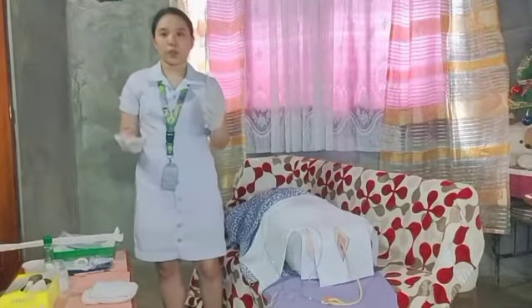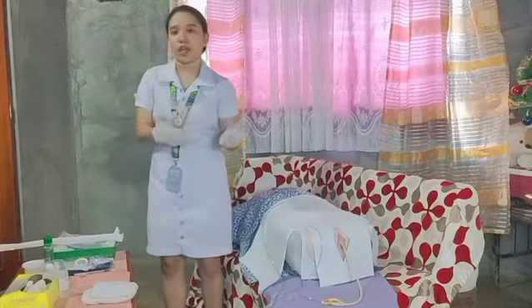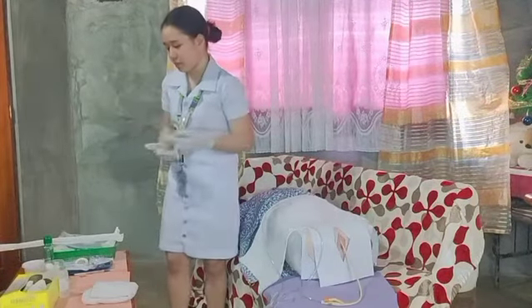So, ito na po yung nakuha natin urine from the patient. And now, ilalagay na po natin siya sa may specimen cup.